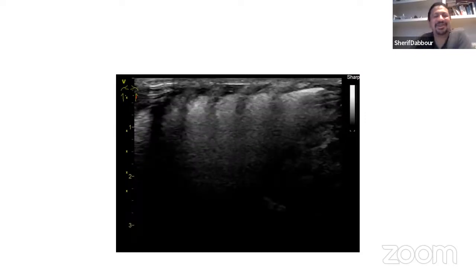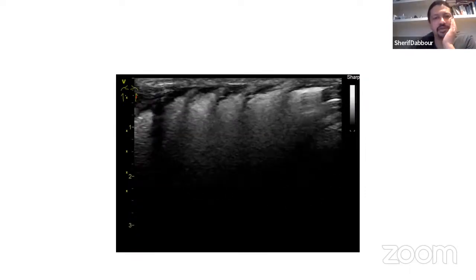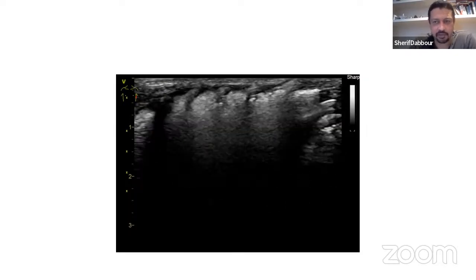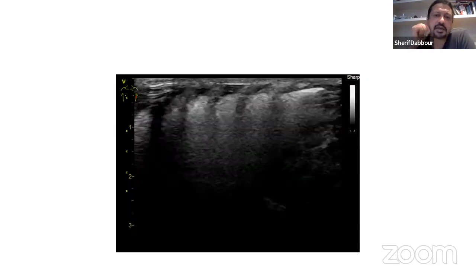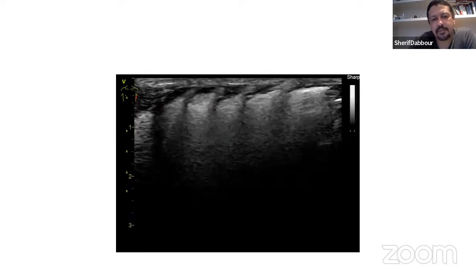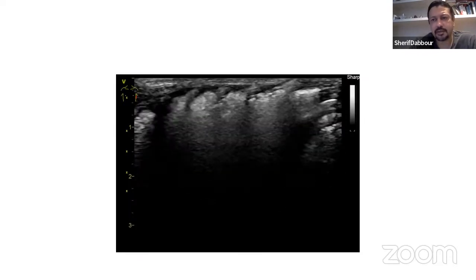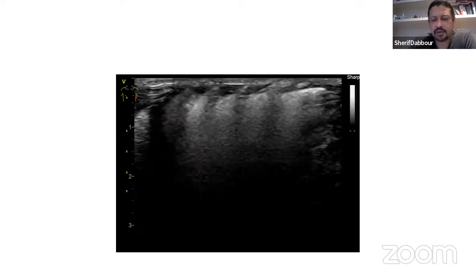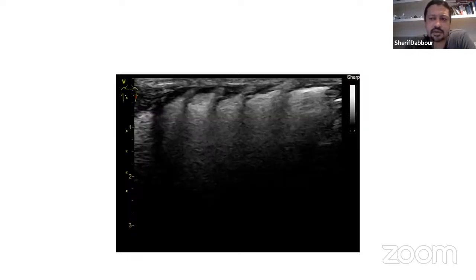Okay, so I write in the pleura that the pleura is sliding and thick, mainly. I could appreciate in most of the slides it was thick, but probably I can talk about the right side and then the left side. So on the right side, the pleura is thick, sliding, irregular, and with subpleural micro consolidations, and there is no evidence of effusion and no evidence of pneumothorax. And mainly the lung, I call it whiteout lung on the right side. On the left side, maybe I could appreciate some A lines, but it's mainly B profile. But on the lateral sides of the lungs, there is a whiteout lung as well. So I would say picture consistent with RDS.